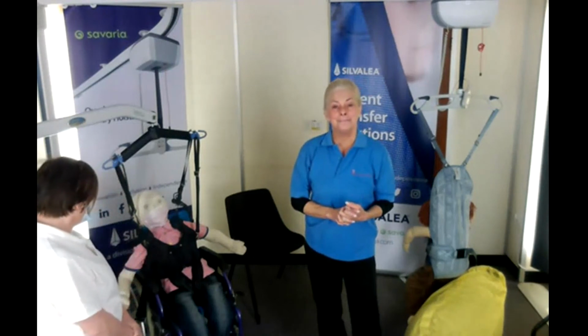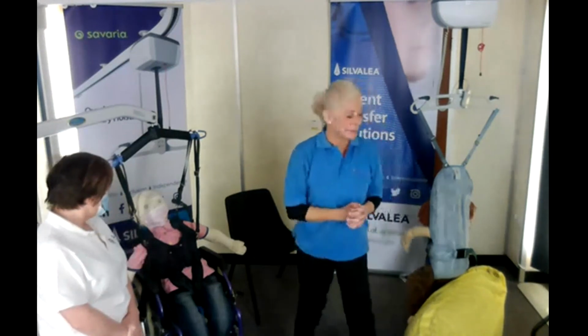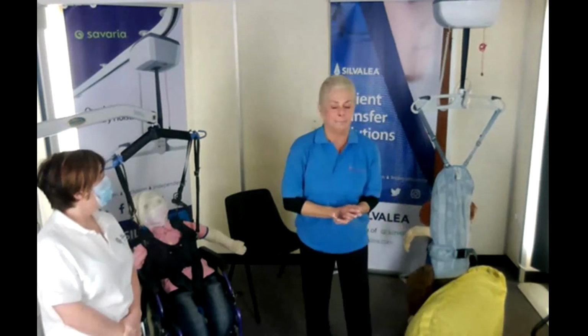Any more? Yeah, the other query is in relation to the plastic replacement for the metal D-rings. These obviously aren't weight bearing, so the plastic ones won't allow you to connect them to the hoist anyway. There isn't an option to. James just wanted to know why it is still there.